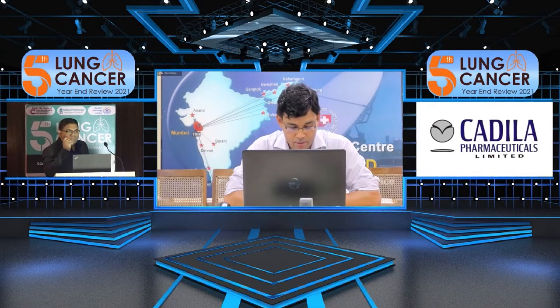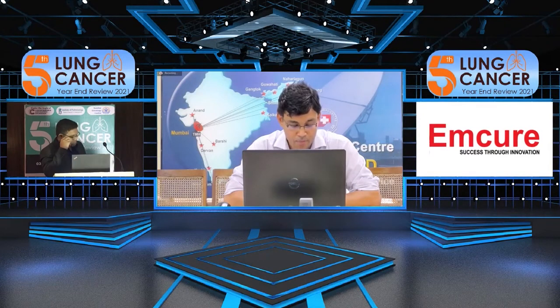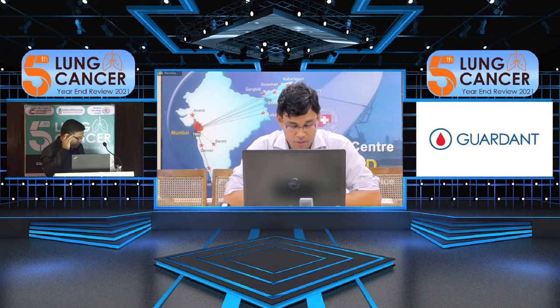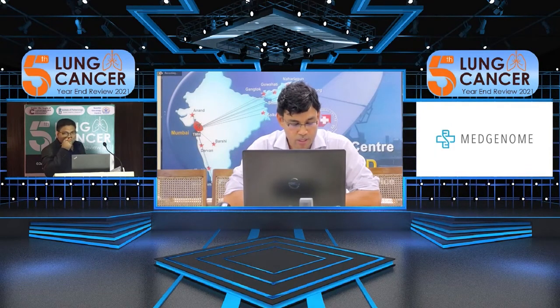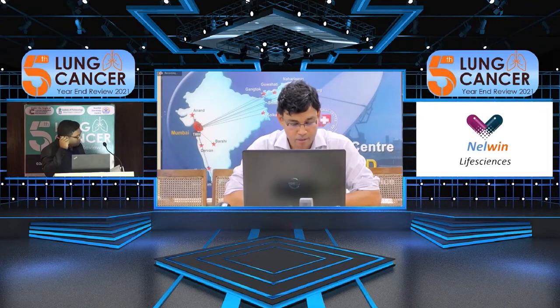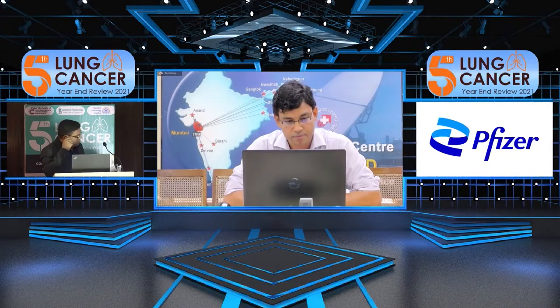Regarding the thickness, yes, we can miss regions if the slice is too thick. The FSPGR sequence will give a three-dimensional picture, and because they cannot print so many images on a film, one should ask for a CD, and it will give the full details. So you can do multiplanar reconstruction, coronal, sagittal and axial, from that sequence, and we can pinpoint exactly where the metastasis is sitting and the number of metastases that have to be treated.